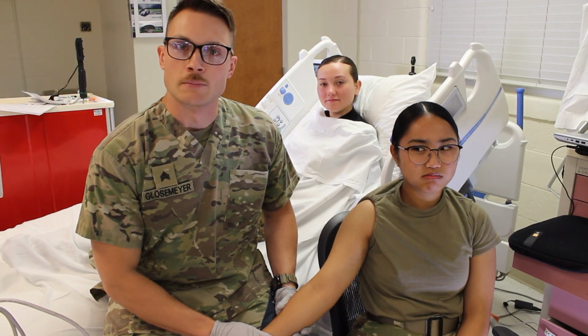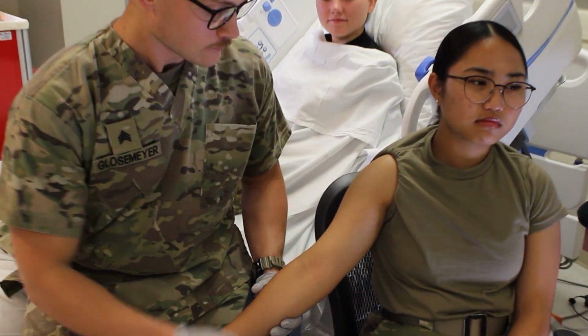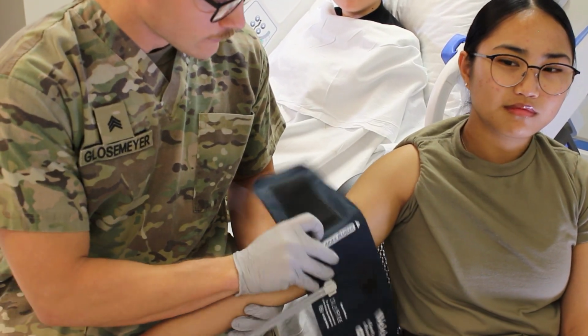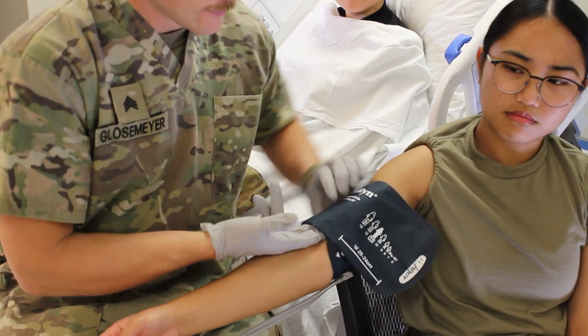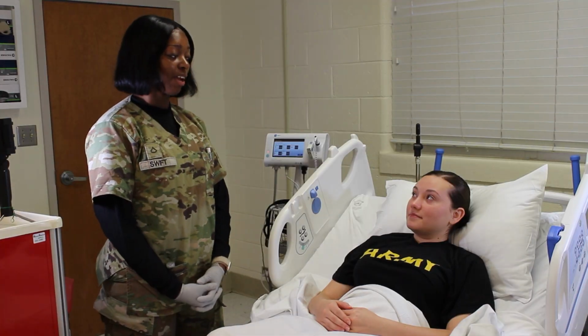Before checking the patient's blood pressure, you want to make sure you find the brachial pulse and line it up with the index marker. Take your fingers, feel the pulsation. Where you feel that, line up the marker, and when you put on the blood pressure cuff, you want to make sure it's not too tight or not too loose. We're done with your vital signs.